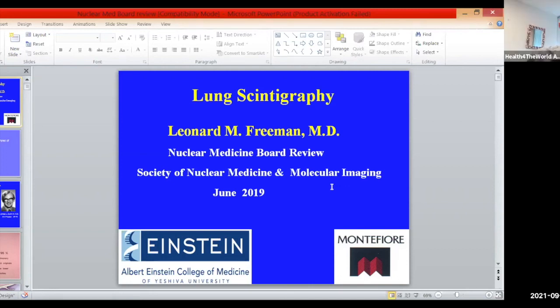Okay, excellent. And then here's a question from Charlene Tang. Is it possible to differentiate CTEPH versus PE on a VQ scan? What was the first thing? To differentiate what? CTEPH, or chronic thromboembolic. See, I'm not familiar with the first thing you're saying. CTEPH is chronic thromboembolic pulmonary hypertension. Oh, you mean, yeah, CTEPH. Is it possible to diagnose whether something is chronic or acute? Yeah, pretty much. I don't think you can from the VQ scan. I think prior.